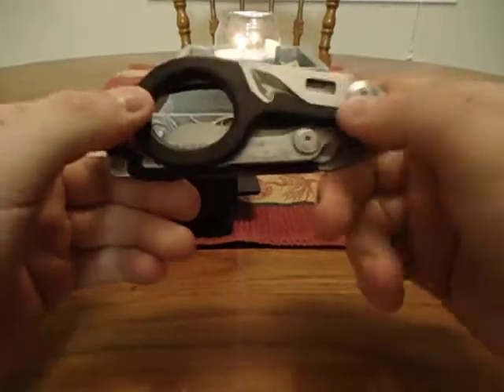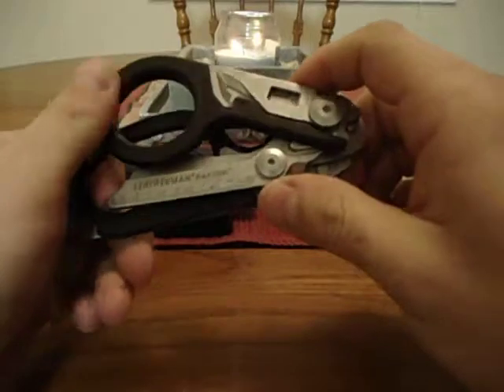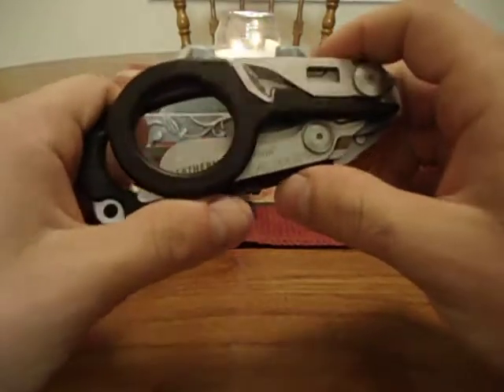If anybody is familiar with trauma shears and how they cut through a penny and all that — well, these cut through butter. They are just amazing. I can't even describe them that well because they're just amazing, plain and simple.